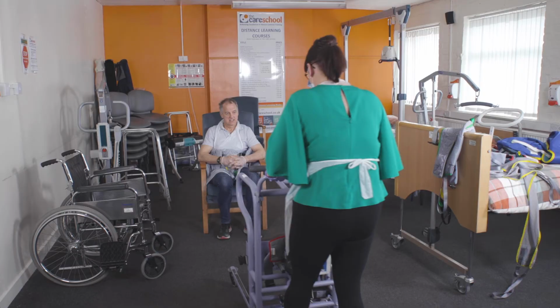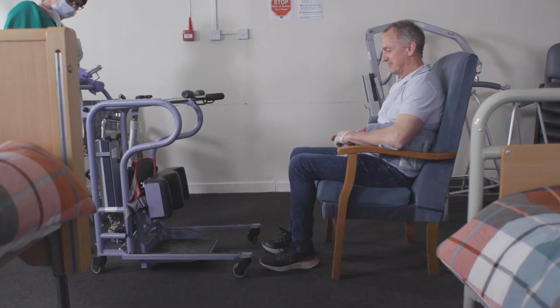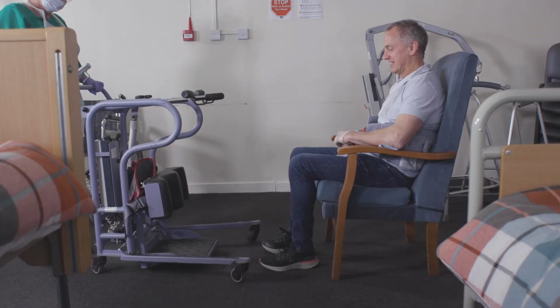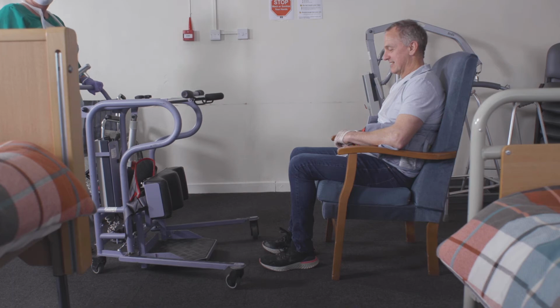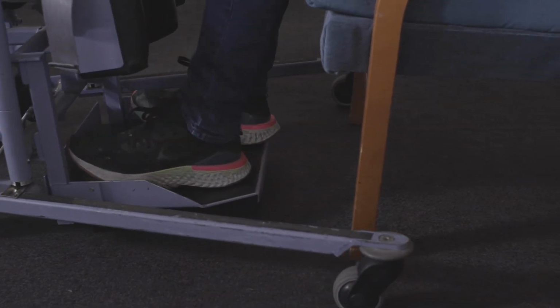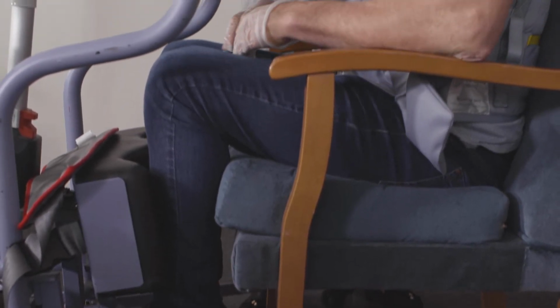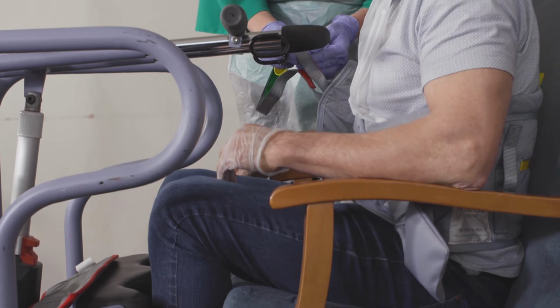Okay, so bring the standing aid in close to the chair. When it reaches the chair, open the legs and then bring the standing aid in. At the same time, ask the service user to lift their feet onto the plate. Their knees should be pressed in against the pads.